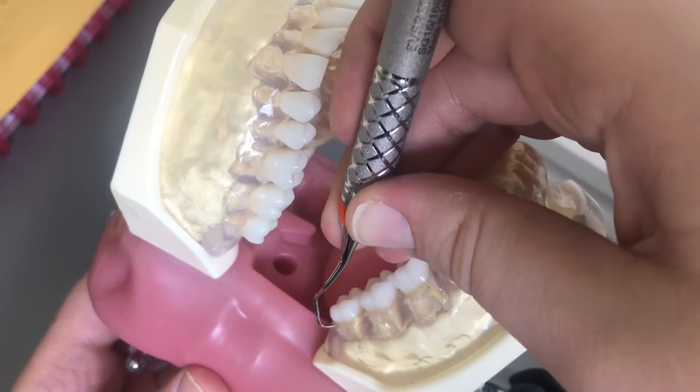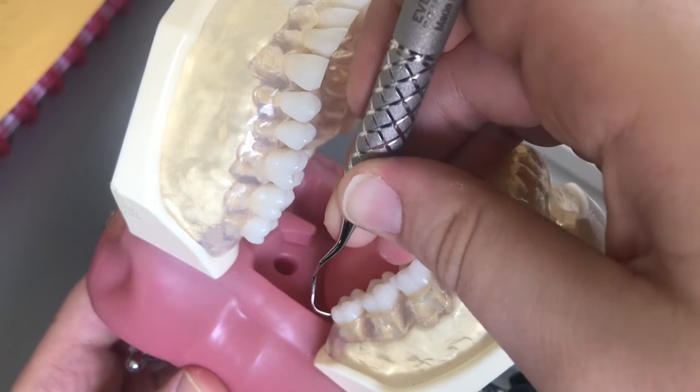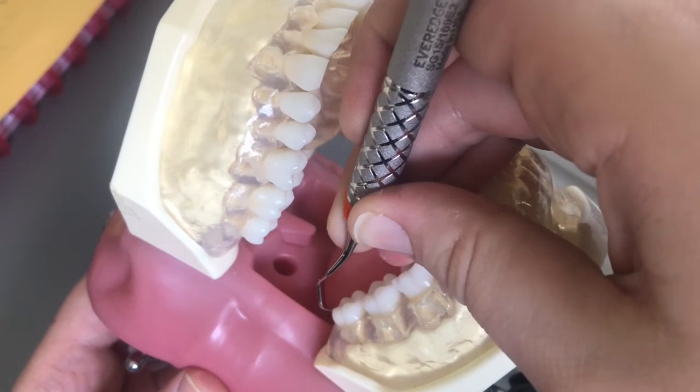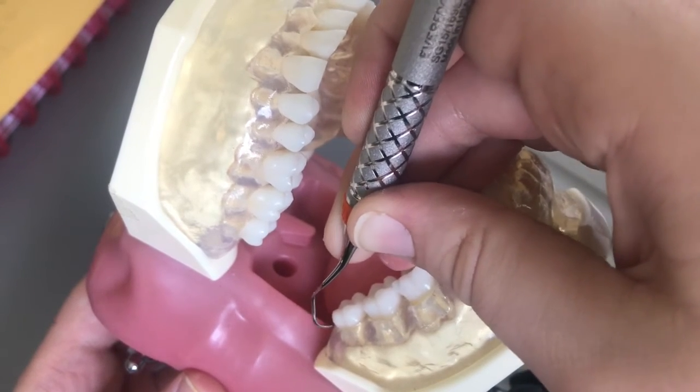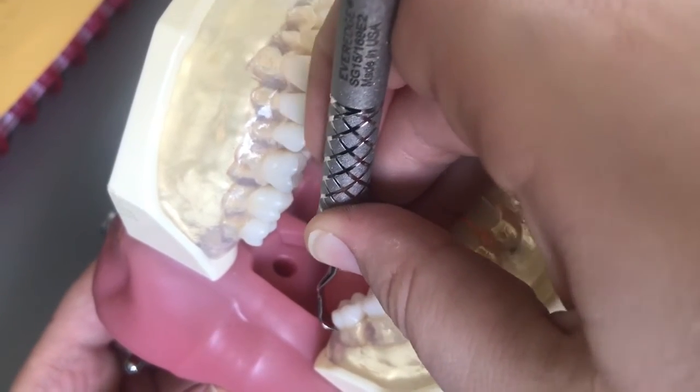Again, want to start at that distofacial line angle because we're trying to pick up where that 13-14 will leave off, or would have left off. So we want to overlap.